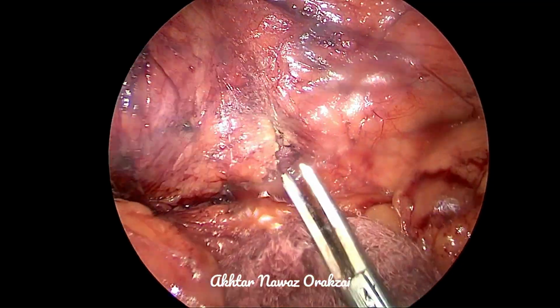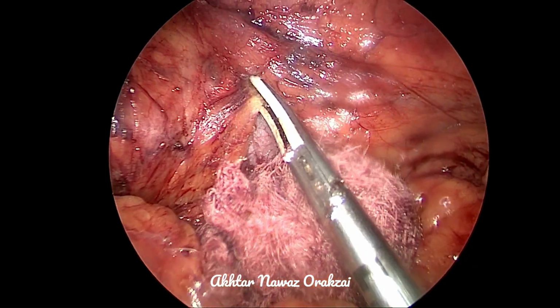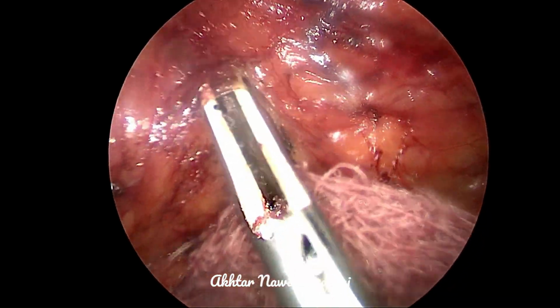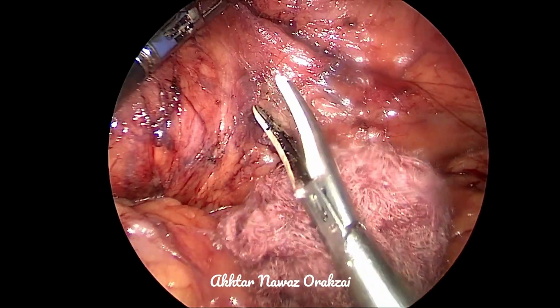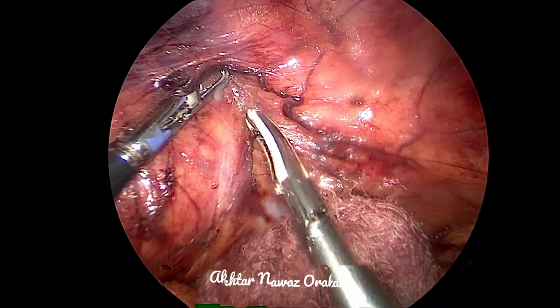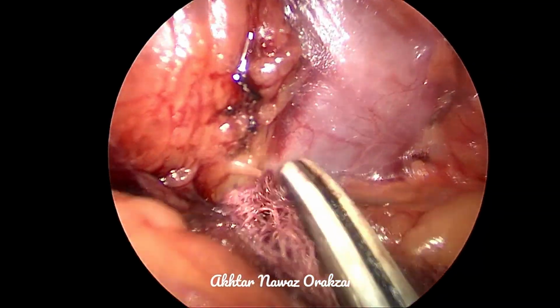The main aim of doing this dissection in adrenalectomy for Pheochromocytoma is that before manipulating the gland, we have to immediately dissect the adrenal vein, and we need to clip it as soon as possible before manipulating the gland.